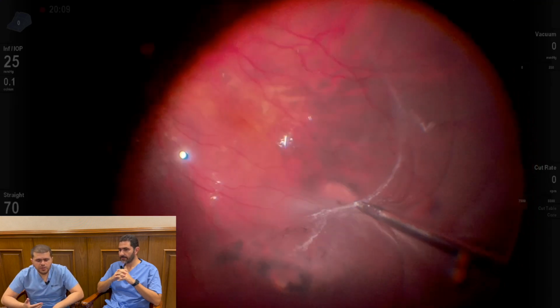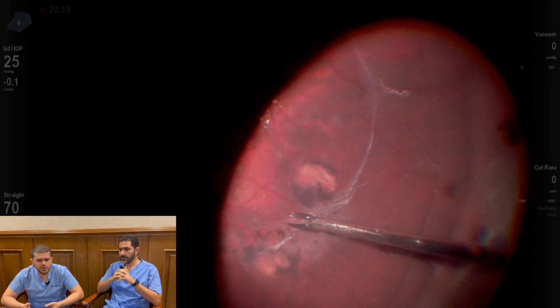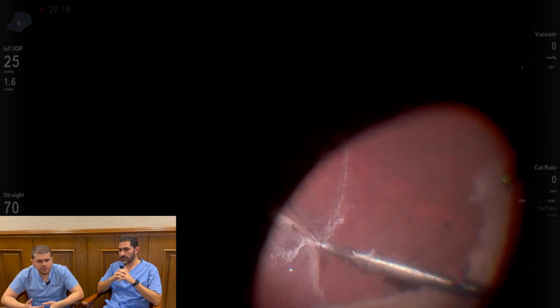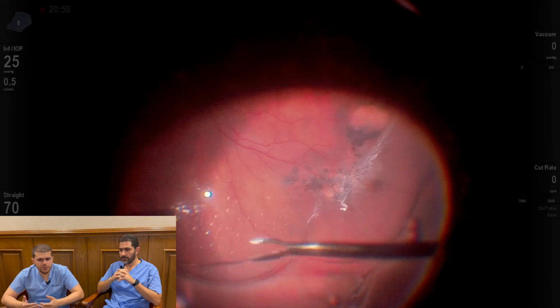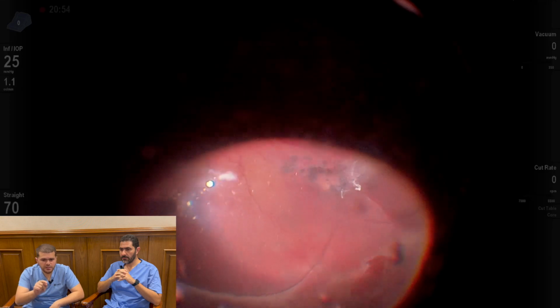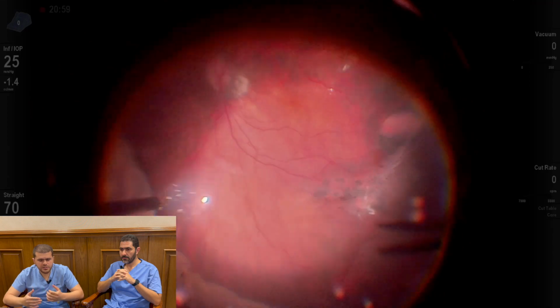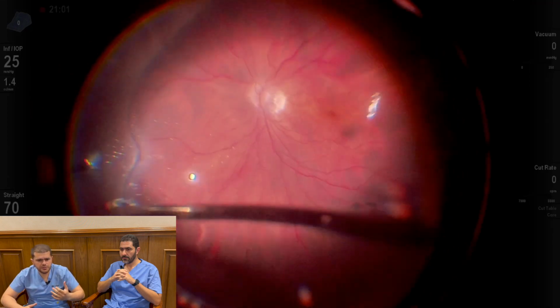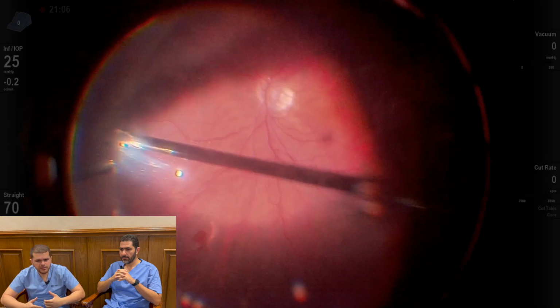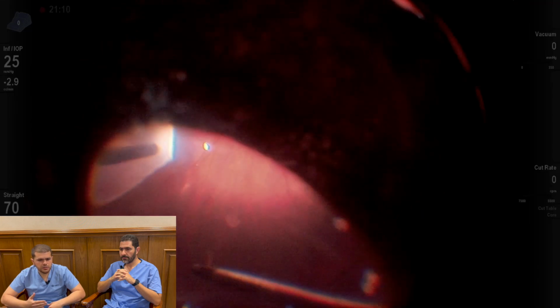Easier. Yes. So what I want to say is that in these cases you have to take your time, and not get bored easily, and just put yourself in a mental status that you will take more time in this case than other cases. So here there was a tear and an operculation, but as we can see, previously in the video, it was tightly adherent and difficult, but as time goes by, with more hydration and more force, it comes out more and more easily.